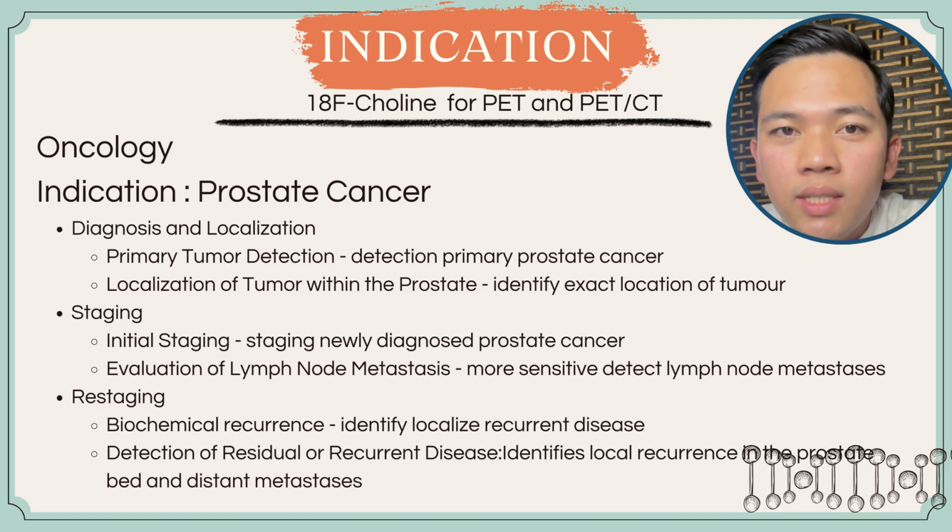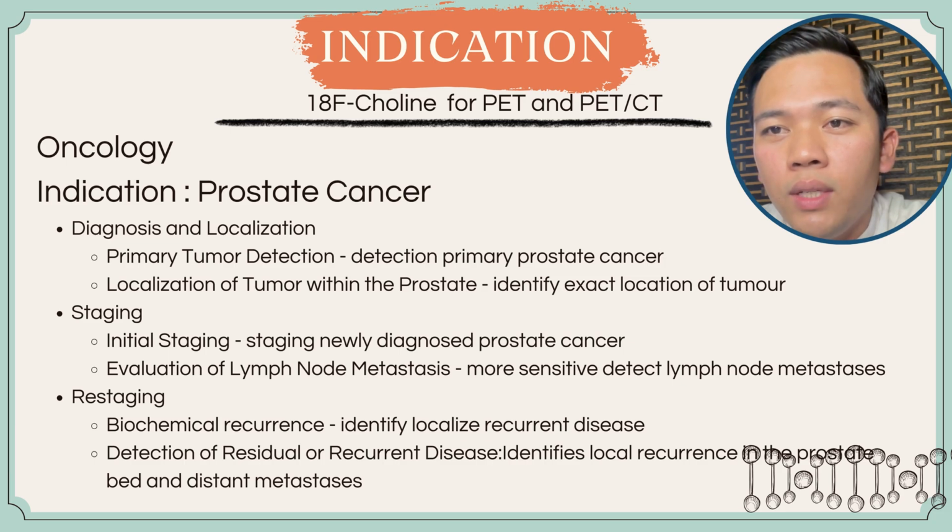For the initial staging, when the prostate cancer is newly diagnosed, determining the extent of the disease is essential. 18F Choline PET CT is useful for initial staging, helping to detect lymph node involvement and distant metastasis. This information is vital for selecting the appropriate treatment strategy.